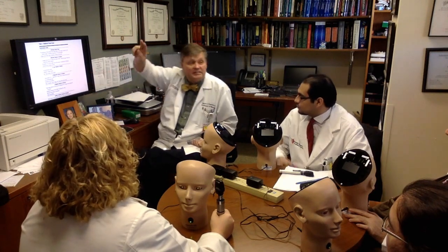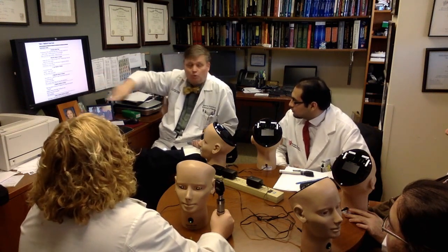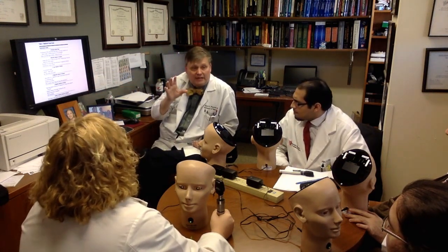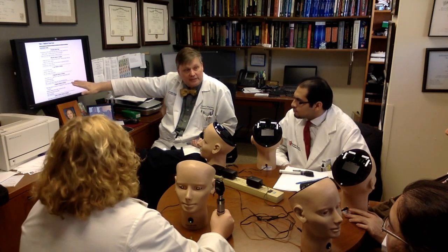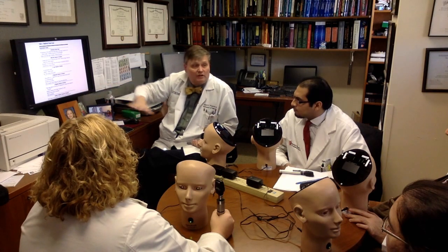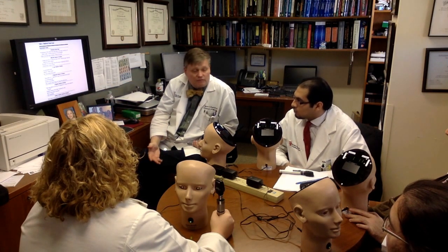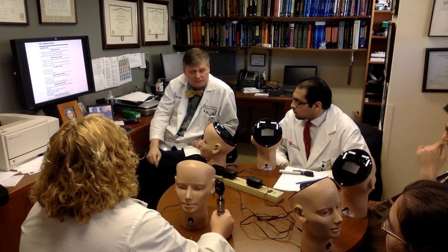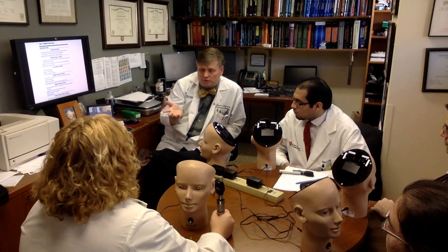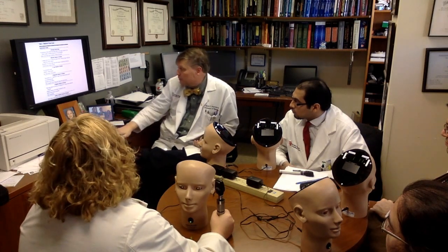Grade 2 means the entire thing is swollen. Grade 3, it's swollen and the optic nerve head is elevated, and you're starting to lose some blood vessels as they enter the disc. Number 4, you have loss of some of the major blood vessels as they go to the disc. And 5 is total obscuration of all the blood vessels of the disc. From our point of view, it's not important to tell 4 versus 5 or 3 versus 4, but to identify papilledema.